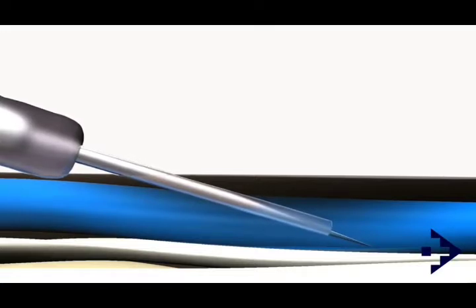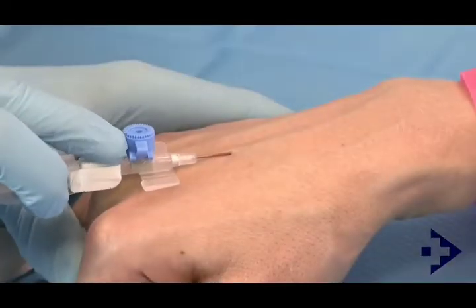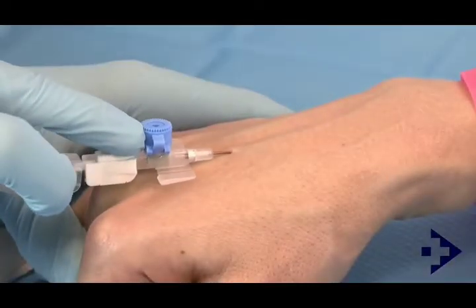At this point, the cannula can then be smoothly advanced over the needle by moving the hub of the cannula towards the skin's surface.